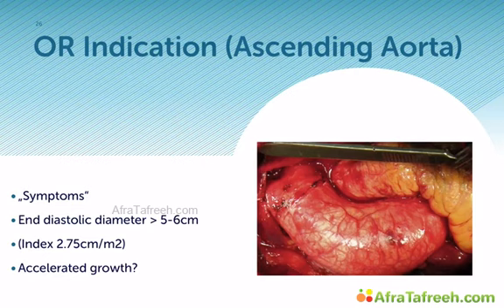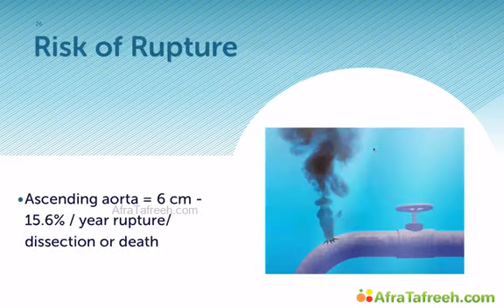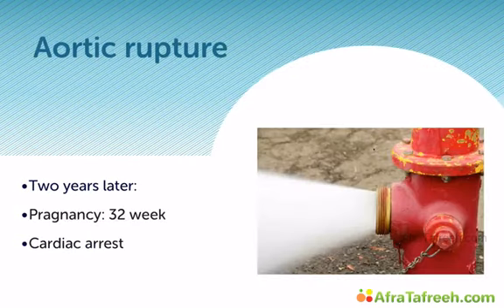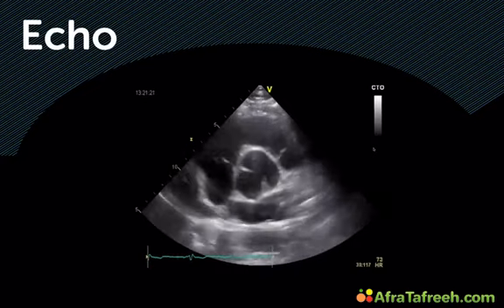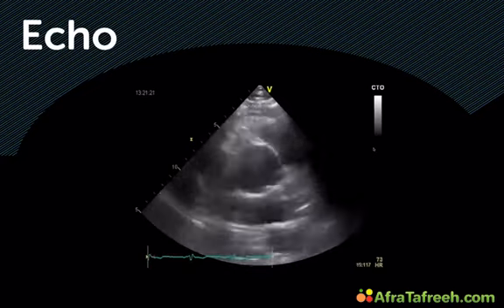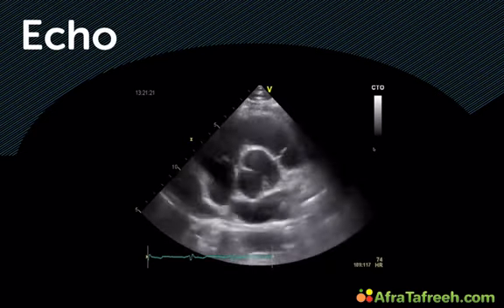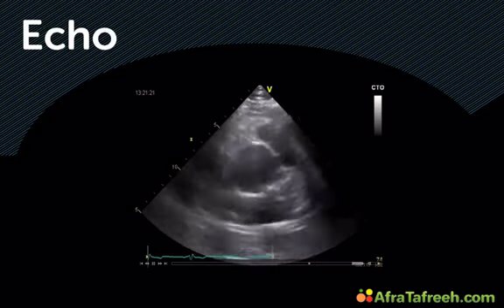I just got a question in from Heiko asking if in bicuspid valves, the orientation, as we see it in this patient here, is always in this orientation. No, as a matter of fact, not. There are many different variations. You can sometimes have it horizontal, vertical, or very frequently diagonal like this.